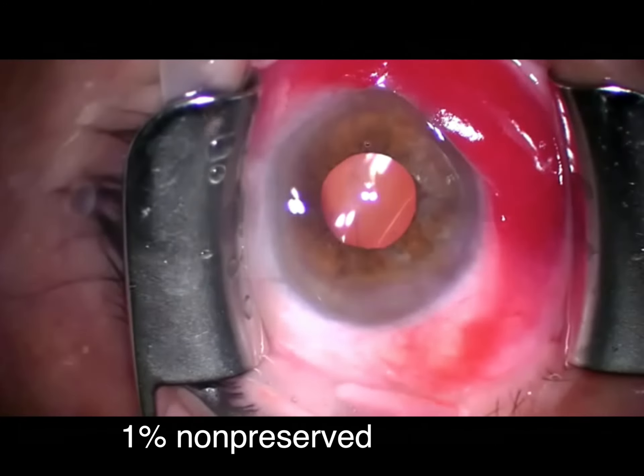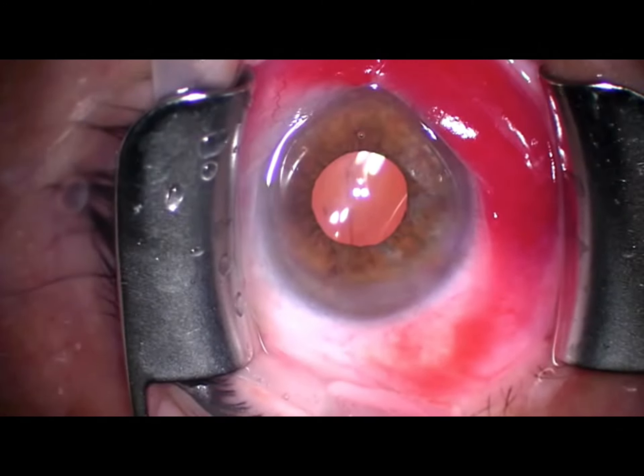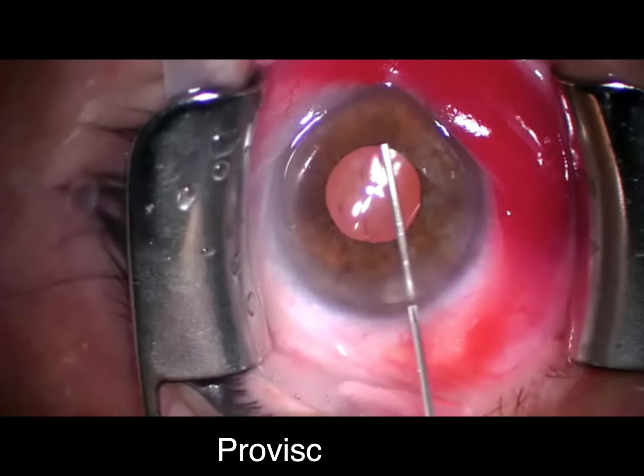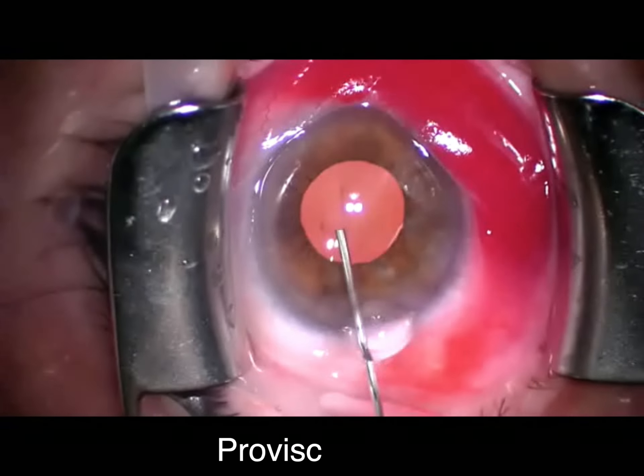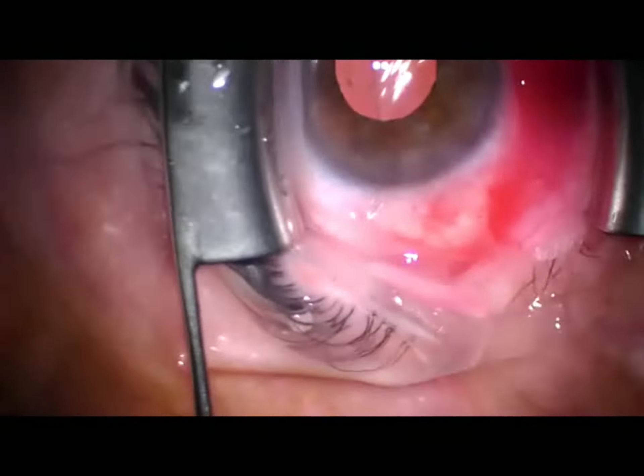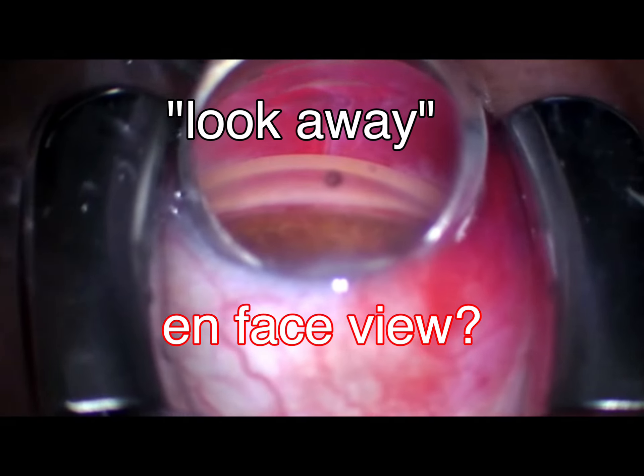A little bit of my staple medication, a little bit of one percent non-preserved, and of course you saw me doing my subconj two percent with epi in the beginning. It's going to load the anterior chamber with the Provisc, and then we'll reposition the head as usual. I want to pick up here when the case gets more interesting.